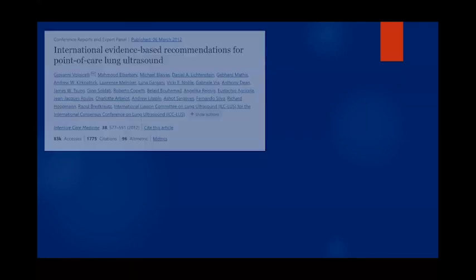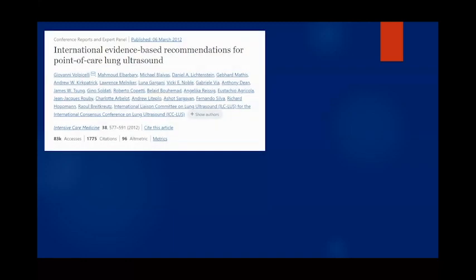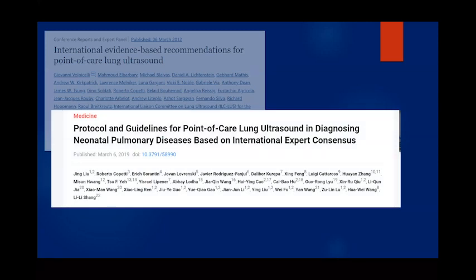And I think it's important at this point to look at the literature and the evidence behind it. So 28 experts from around 8 countries sat and tried to standardize the use of lung ultrasound in different settings. And they put out a set of indications for performing lung ultrasound. They also focused on pediatrics and neonatology as well. There are also publications out there that are more of a technical report on how to perform lung ultrasound, especially for neonates, talking about the specifics of what machine to use, what depth to use, and how to report it.